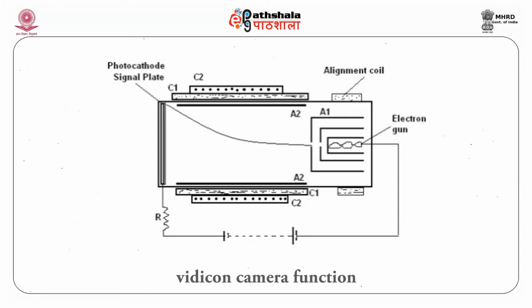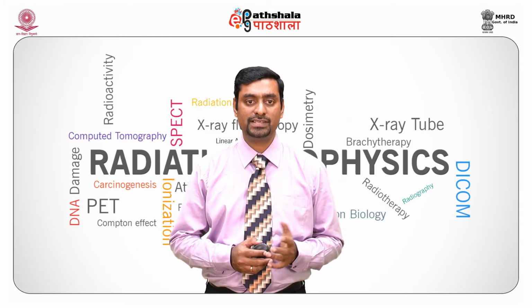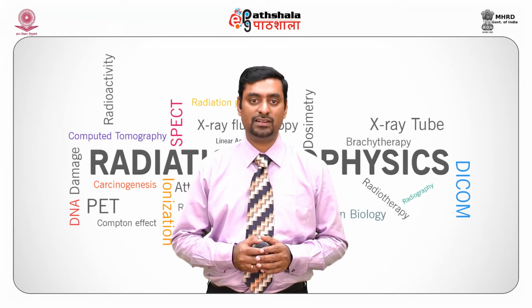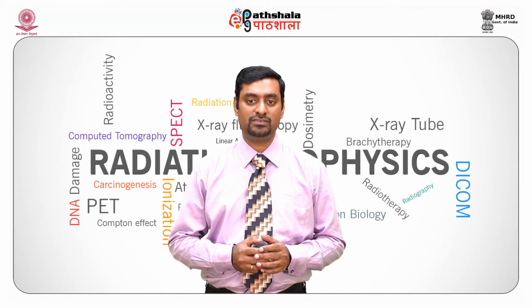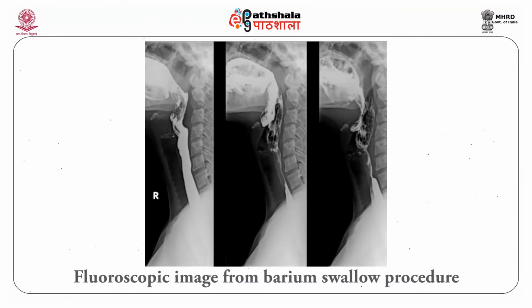shown in the figure, and converts the electrons in the image into current flowing through the resistor R connected to the external circuit. This camera produces a signal voltage which can be amplified and fed into the television monitor for viewing. There is an illustration which is seen in the image, a fluoroscopic image from a barium swallow procedure.